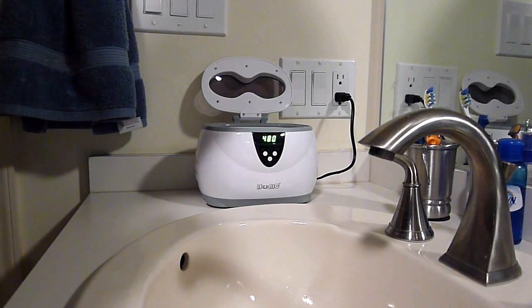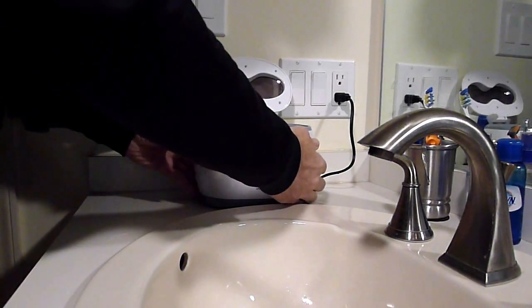The ultrasonic cleaner cleans with sound waves, getting into the little crevices and the little porous surfaces that you really visibly can't see with other methods.